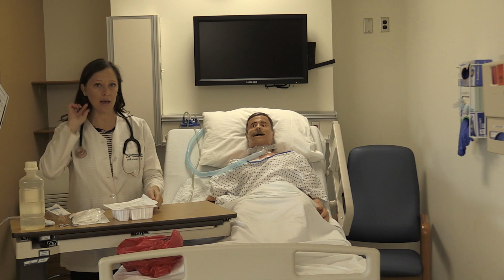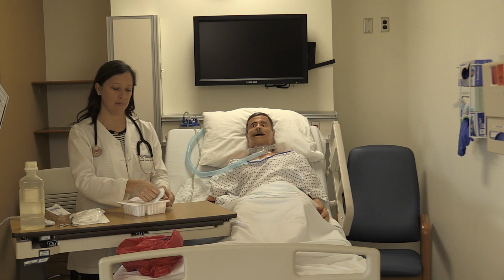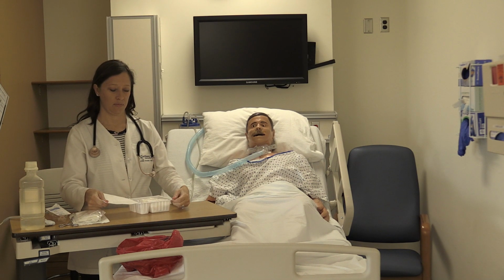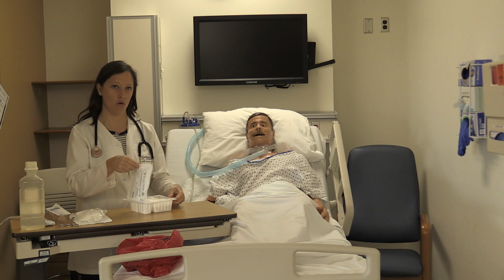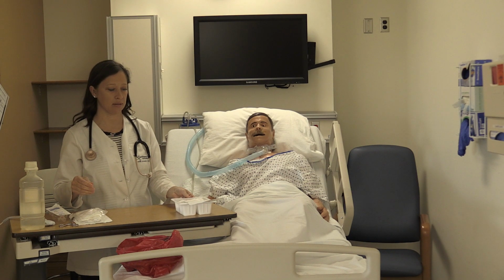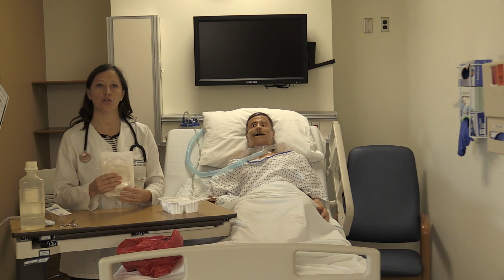Okay, so for the tracheostomy care kit, you want to open it very carefully, making sure that your cover does not go back over your supplies. And then you want to open your suction tubing.